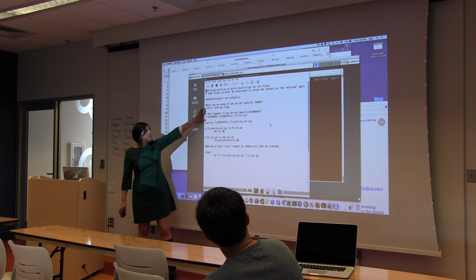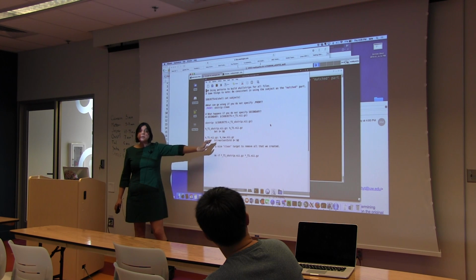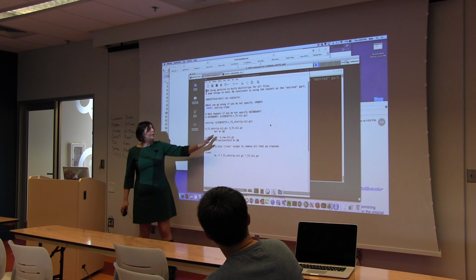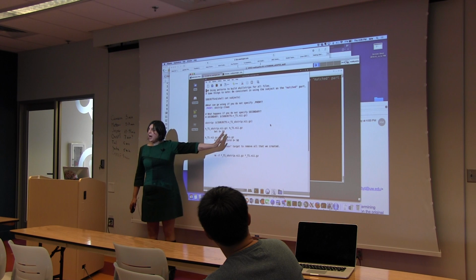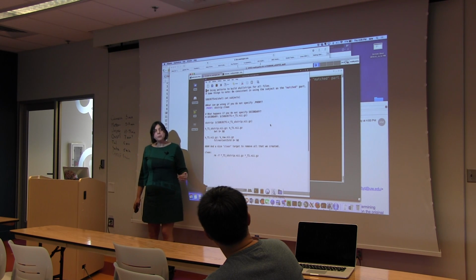Okay, I will skip over the phony right now and just show you what the skull strip target looks like. Here, we want to do the skull stripping for all of the subjects. So what we do is we use a sort of pattern replacement thing that Make has. All of these things, by the way, are built into Make, which is in every Unix system.